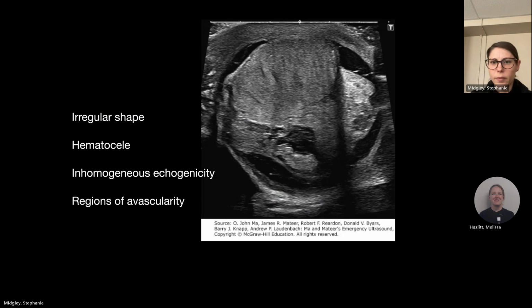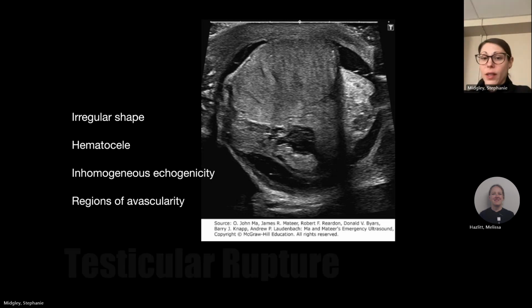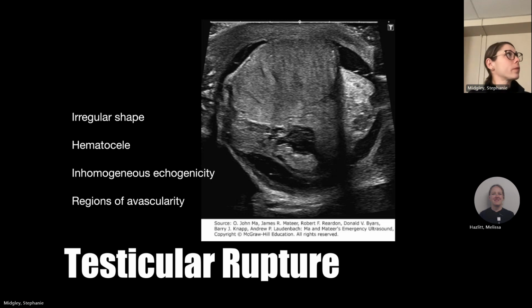All right. What do we have here? It has all the answers on there, but what is it? This is in the setting of trauma. Yeah, exactly. Testicular rupture. So kind of even just like globe rupture, you're going to get an irregular shape.